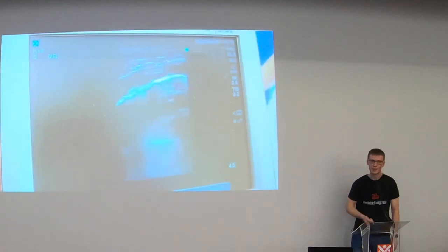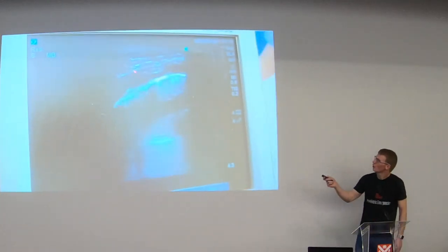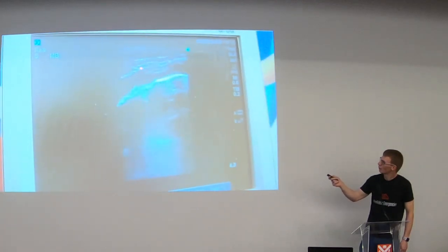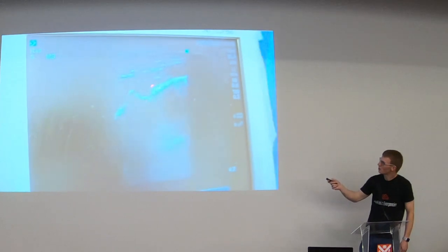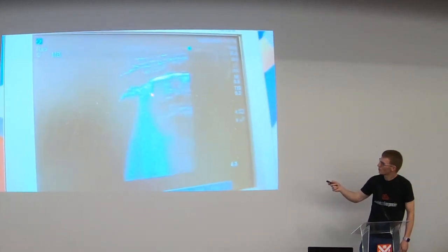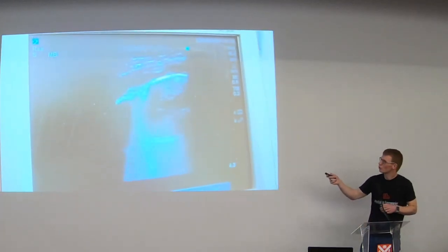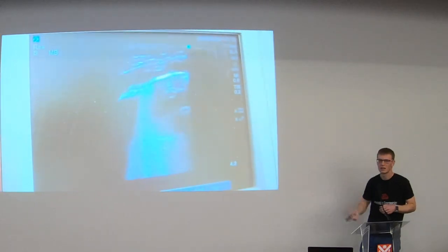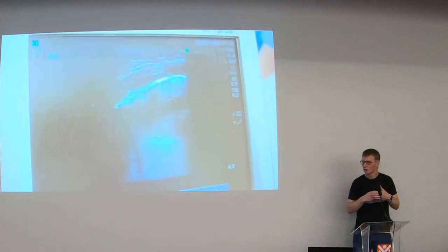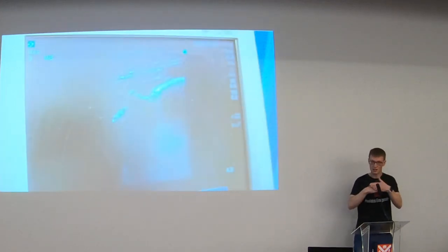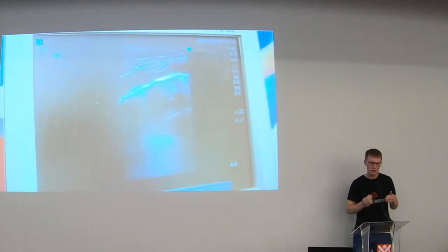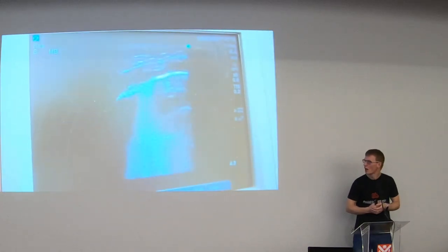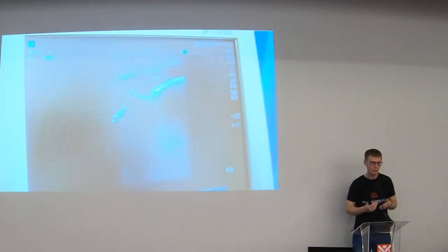So what you've got here, you've got a rib shadow here, rib shadow here, intercostal muscles in between them. You've then got this white shimmering sliding line here and you've got these comet tails and B lines coming off this line. So ignore all the other bits I've told you. What you're looking for is just this white shimmering sliding line. What that is is the two layers of the pleura sliding over each other. And that's what it looks like. It looks like something sliding over each other. And if you see that it tells you the two layers of the pleura are in contact with each other. They couldn't be sliding over each other if they weren't in contact.